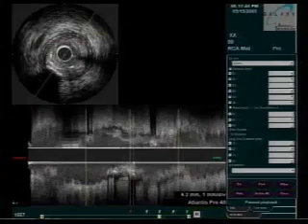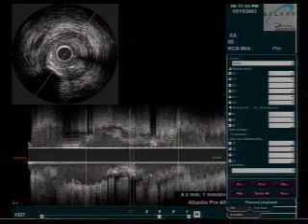It looks pretty good. I think it needs to go a little bit further, actually, Bill. I was reanalyzing the IVUS while you were positioning that, and I spun the view around a little bit. If you want to take a quick look at the IVUS screen, there's the severe area that we all saw, but then there's some moderate disease downstream, which I think we're seeing about where the end of your stent is now. So we're going to want to place that stent cutting the proximal edge fairly close, but give ourselves extra stent downstream, to make sure we cover this other area of moderate disease. That's a good point. The severe lesion is not centered. The most severe portion is towards the beginning of the lesion. Okay. Can we see the live fluoro?